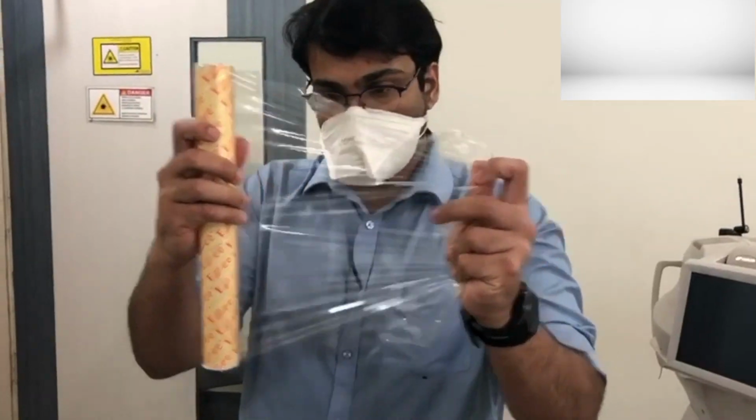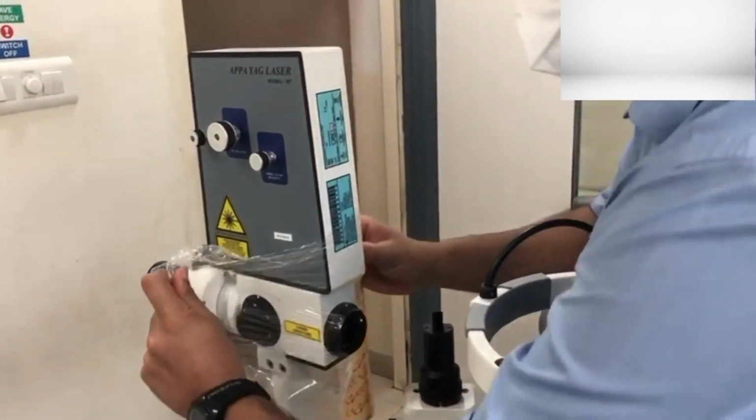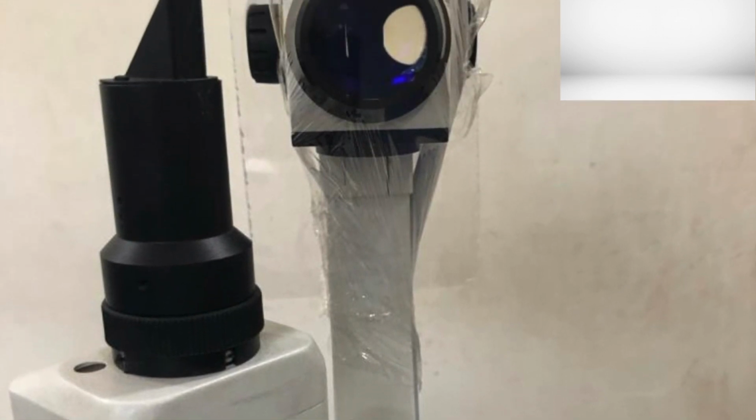A similar method can also be used to cover your YAG capsulotomy laser machine. Here too we observed that the spot size was slightly smaller, but again it was not clinically significant.